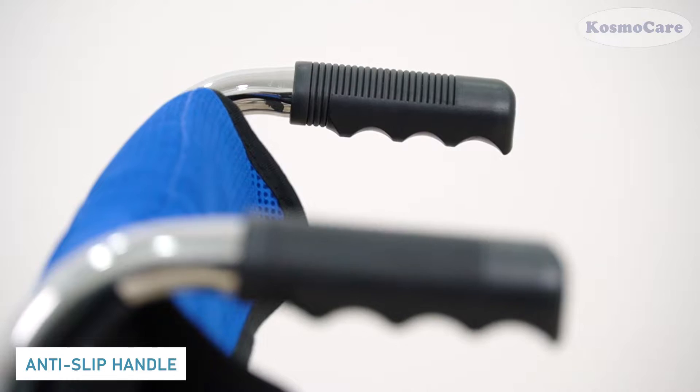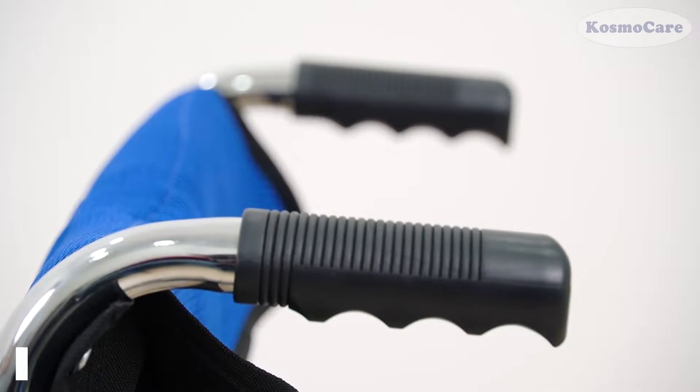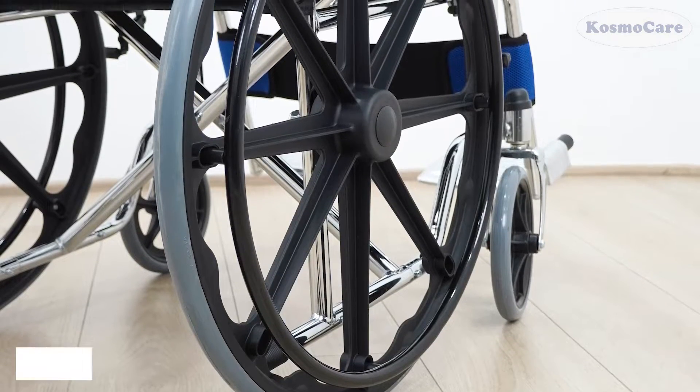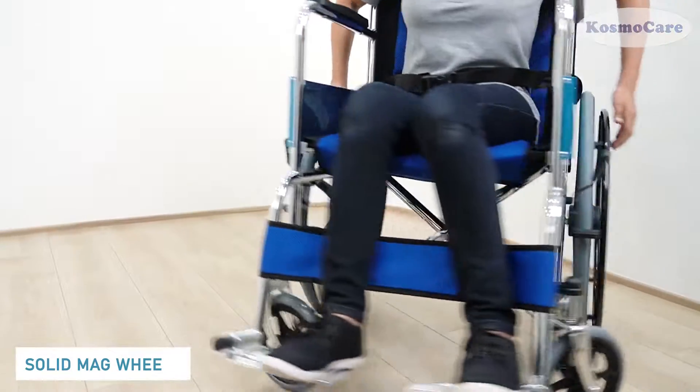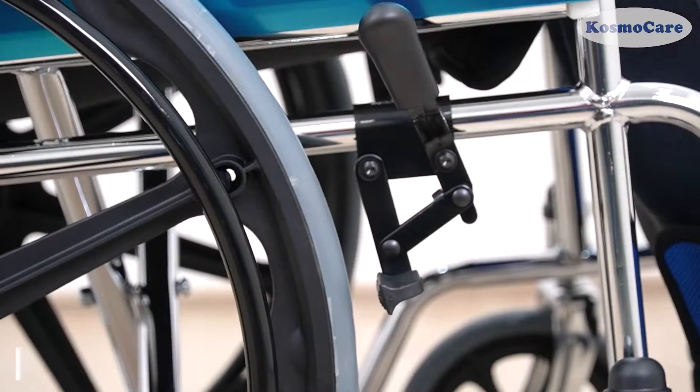The anti-slip handgrip provides secure grip to the caregiver. The solid rubber tires are mounted on composite mag wheels for durability and are low in maintenance while providing a smooth and stable ride.